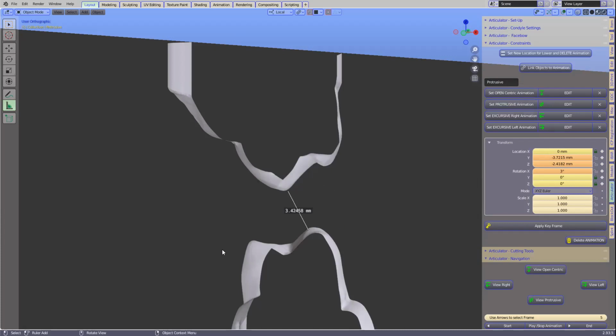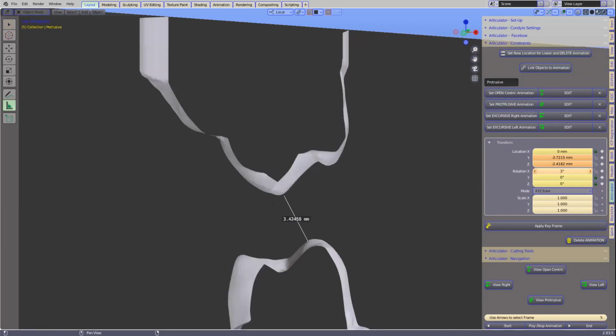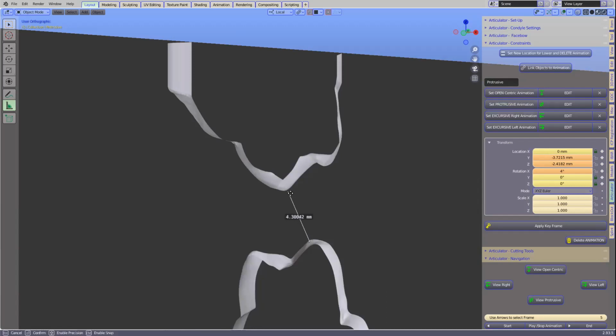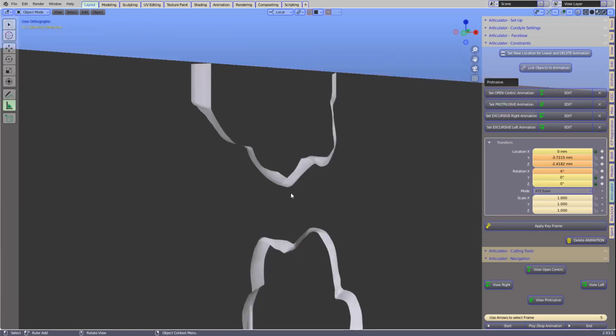Otherwise you're going to do this entire work, and then all of a sudden you'll notice you don't have enough space. You're going to cut through one of the layers, and you're going to have a hole through it or something. Besides taking that distance, the patient has to be in a comfortable, relaxed setting. There's nothing worse than sleeping with your mouth half open and forced apart. You're not relaxing your muscles and TMJ and things like that.